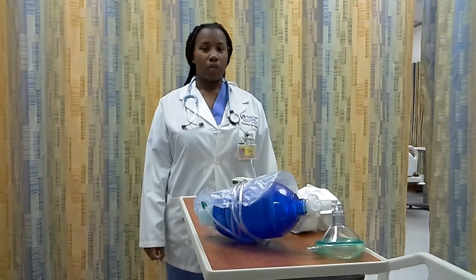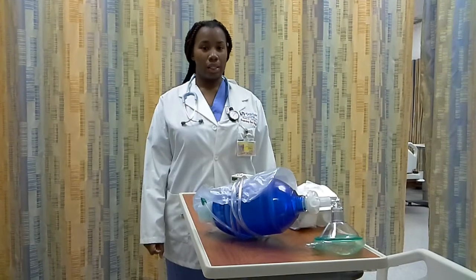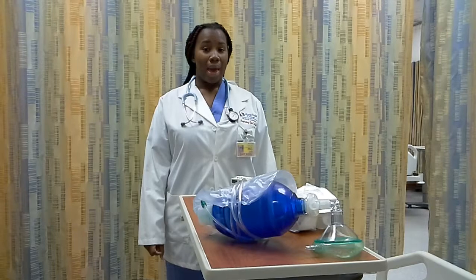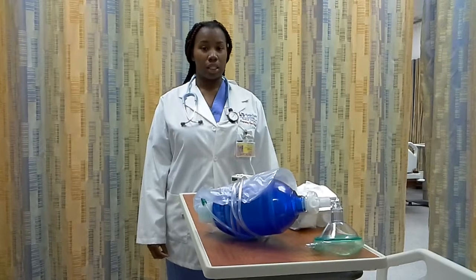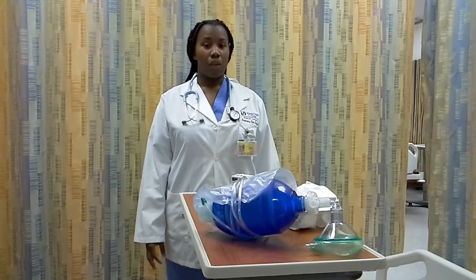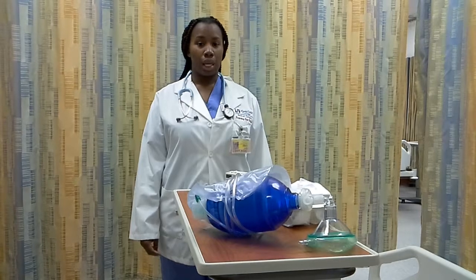The objectives of tracheostomy care are to maintain a patent airway and skin integrity, and also to prevent infection and tube displacement. The indication is any patient that has a tracheostomy tube would require tracheostomy care. The contraindication for tracheostomy care is any patient who has unstable vital signs.